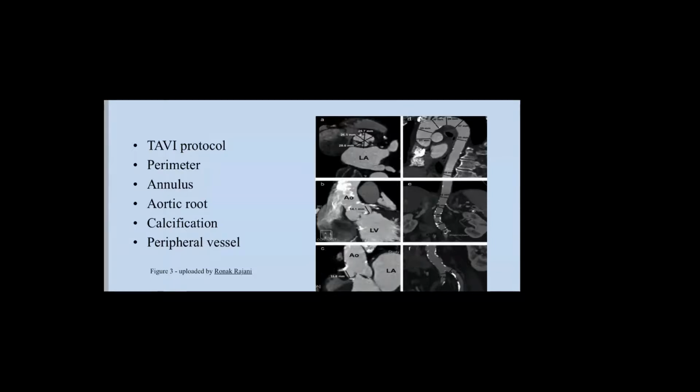A TAVI needs cardiac CT. Can we do without cardiac CT? Yes, we can. But the cost is really high, because you have to do transthoracic echo and TEE with 3D formatting and analysis of diameters, and whatever we do, the accuracy of TEE compared to cardiac CT is like 10% lower, even in the best hands. Therefore cardiac CT, if available, is the best way to go.